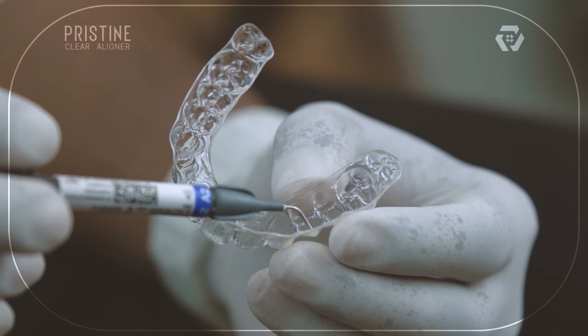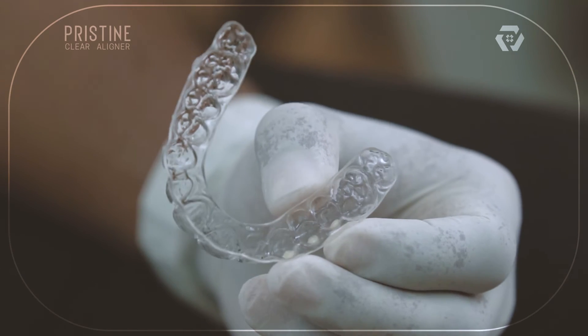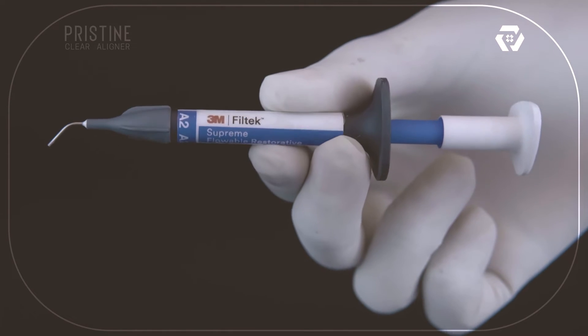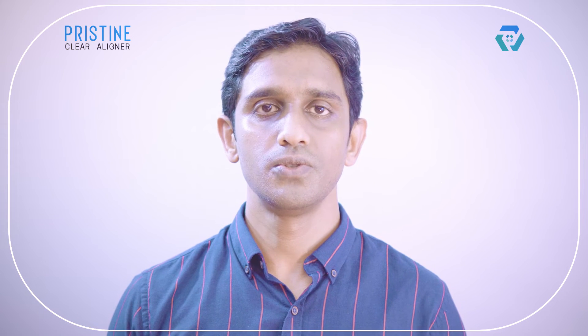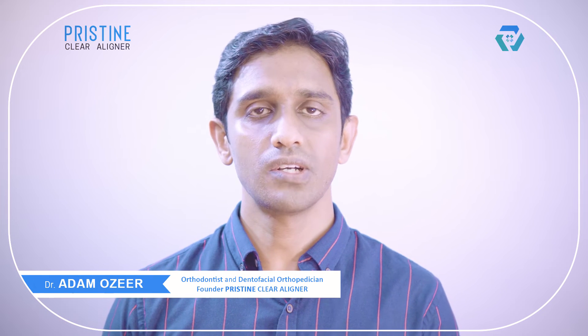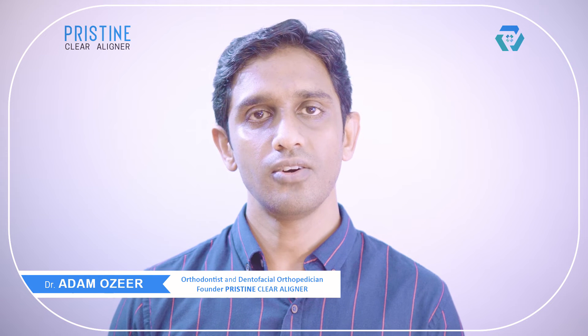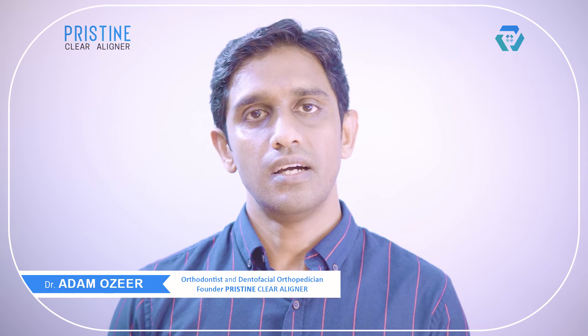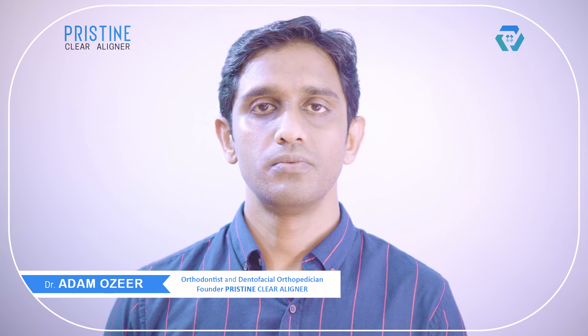Load composite into the template. We prefer 3M Filtek flowable composite, though it is the doctor's preference to choose the brand and whether it should be flowable or bulk-fill. While loading, slightly overfill the template, as underfilling may lead to bond failure.